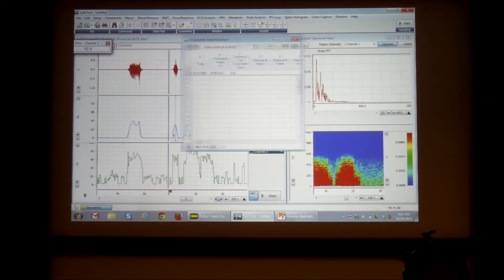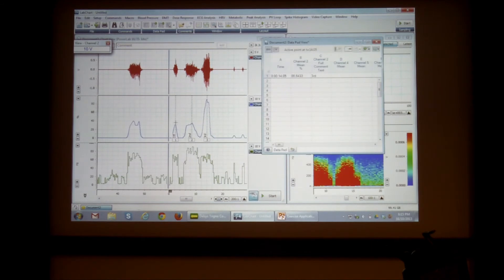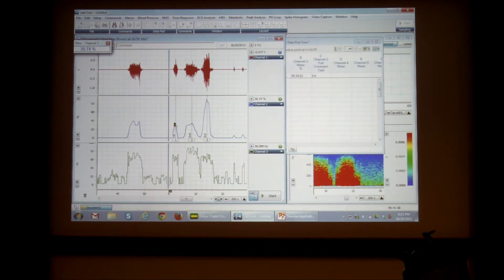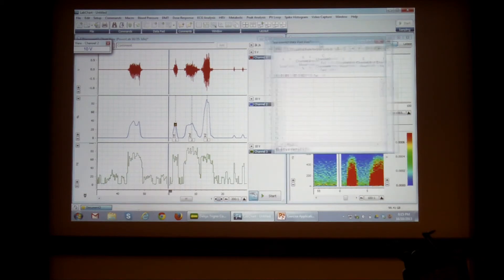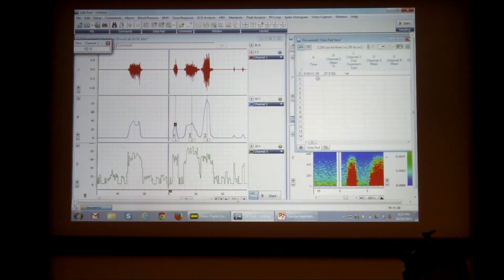So now all I need to do is I can select my data. I'm just going to select a region around the top of my peak. And I click on add.